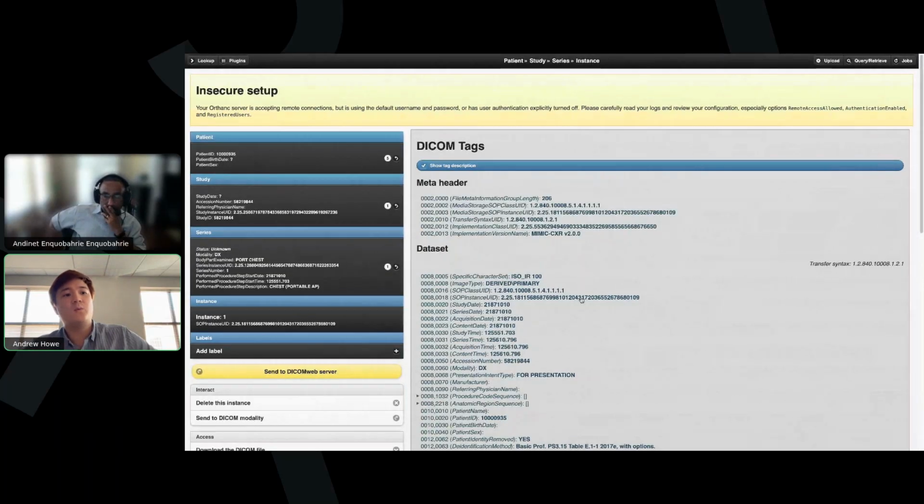But anyway, so we have this Orthanc server. It's also running on our local intranet. And you can run a PACS in a locked down setting or you can run it in the cloud and you can have a connection to a PACS located on a different machine.